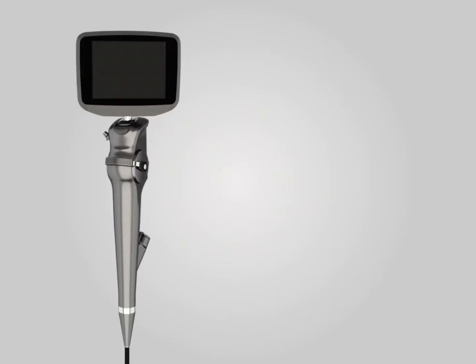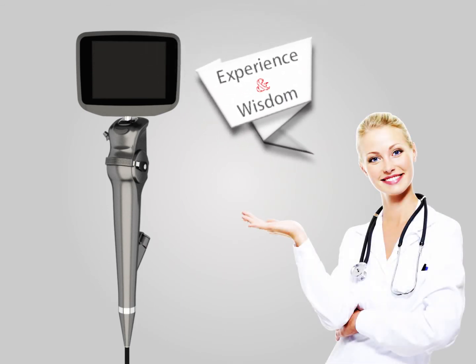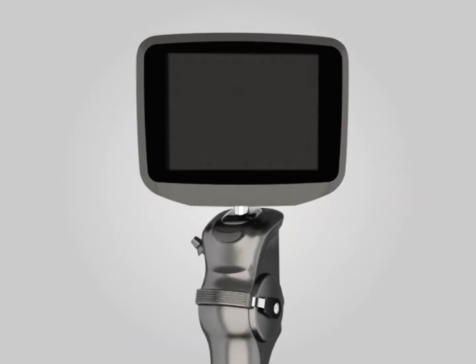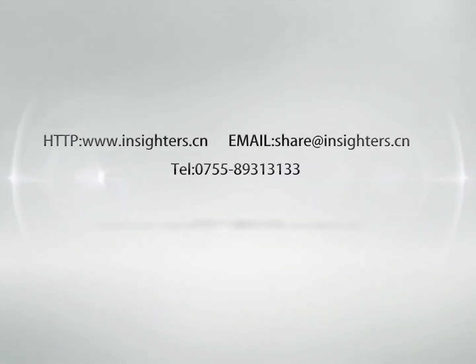The INSIGHT IS3 is a valuable assistance tool in airway management. Understanding that the experience and wisdom of doctors are most valuable, IS3 is designed with powerful multimedia functions, including photography, video recording, and sound recording, so that doctors can conveniently document clinical cases and use them for academic sharing, teaching, and clinical backup.